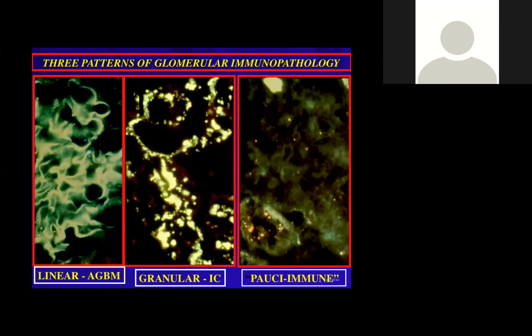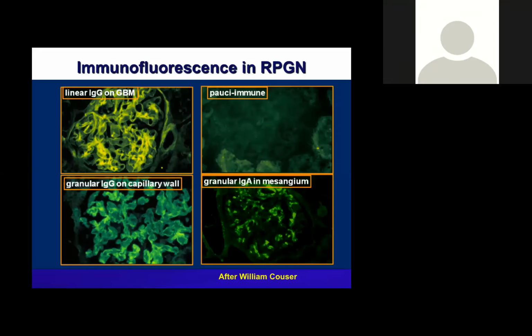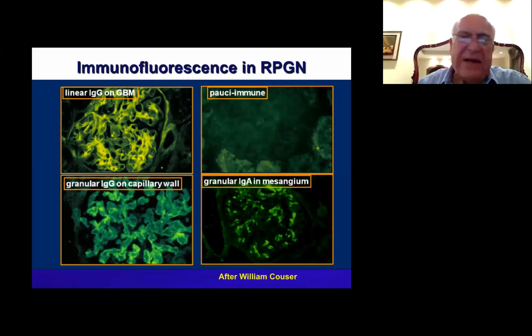If you just have the light microscope, you should go for the second step in evaluating a renal biopsy specimen. So we will go for immunofluorescence or immunohistochemistry, and if it is not resolved, we will go for EM. Not every place has EM. We have in our facility light microscopy and immunofluorescence. We can have it on the same day or the next day of the biopsy.